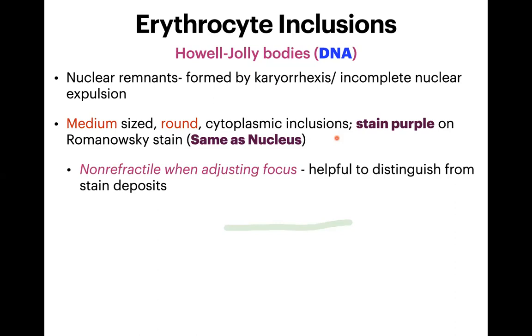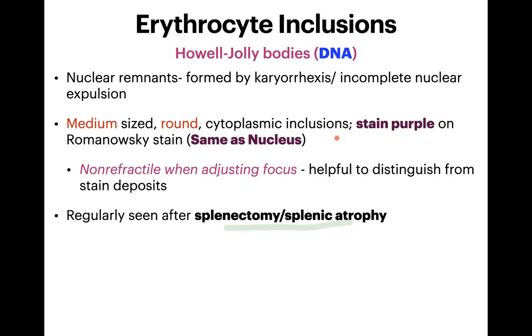They are non-refractile. So how to distinguish them from the stain deposits? Just adjust your focus up and down. The stain particles will be refractile, but these Howell-Jolly bodies will not be refractile. They are regularly seen after splenectomy or splenic atrophy.